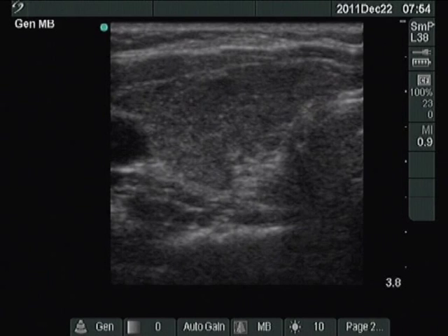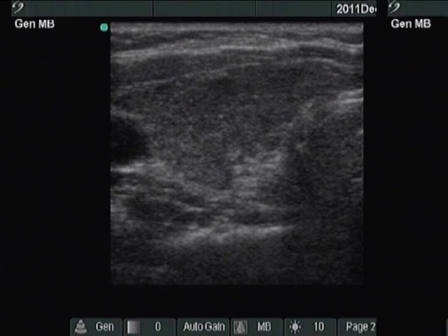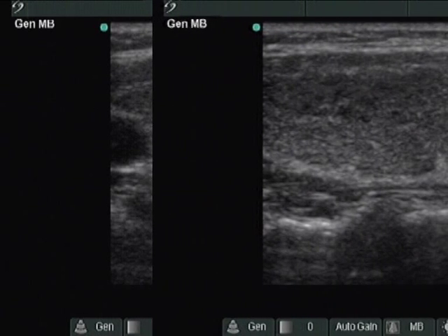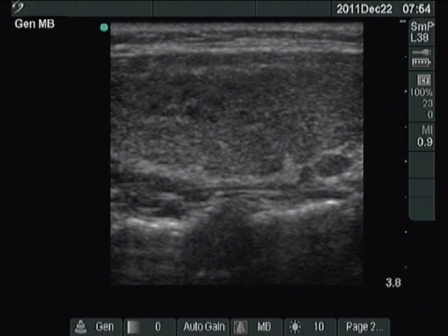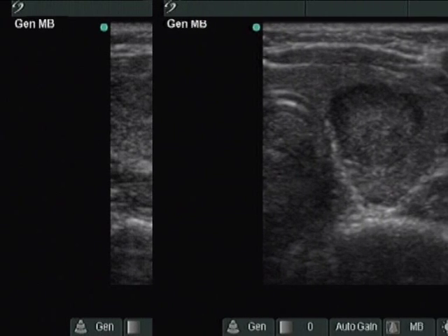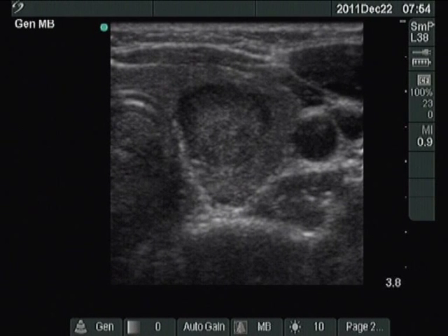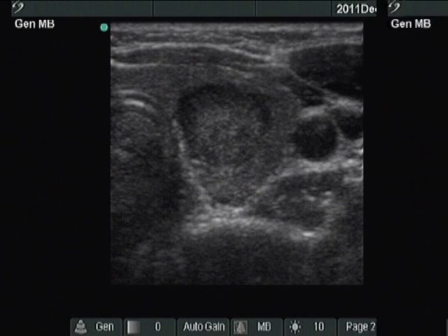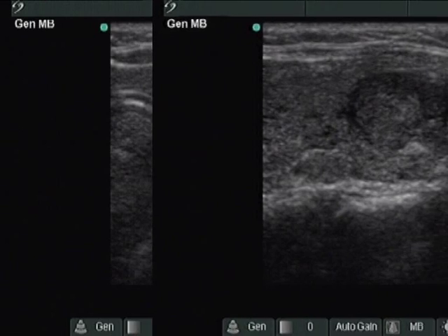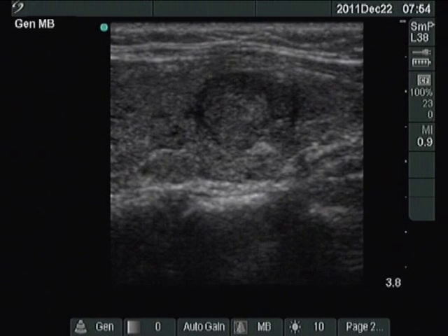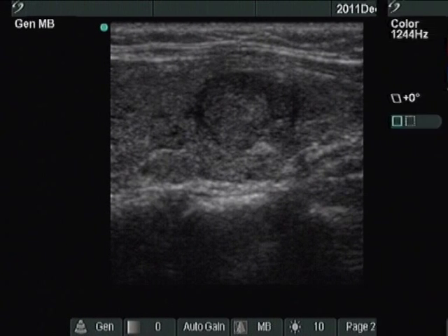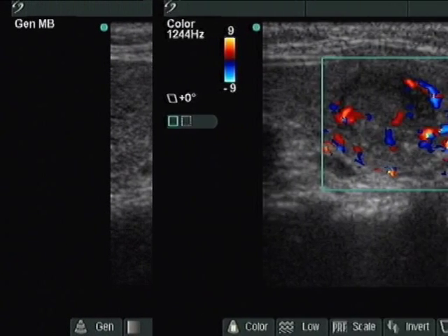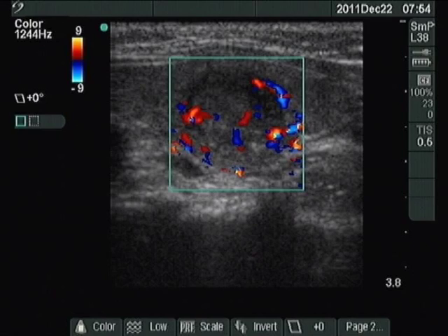The right lobe is moderately hypoechoic and corresponds to the underlying Hashimoto's thyroiditis. There is a small lesion with an echo structure identical to the extralesional part of the thyroid. However, this lesion contains microcalcifications and has irregular borders.